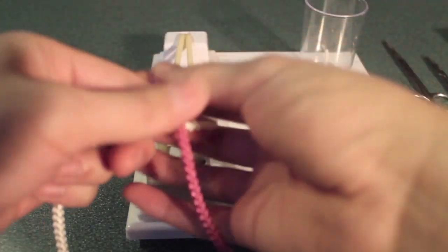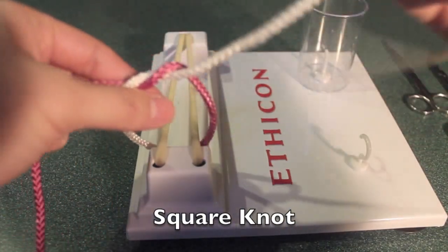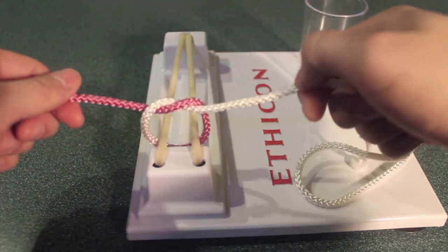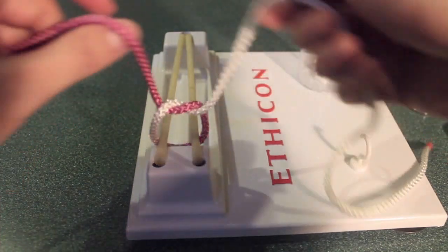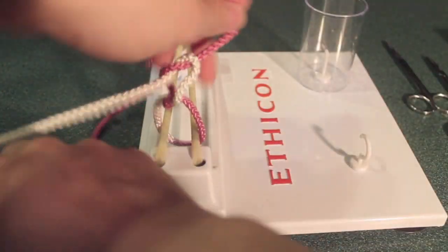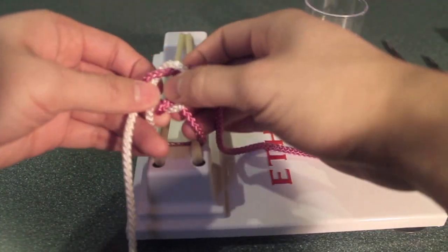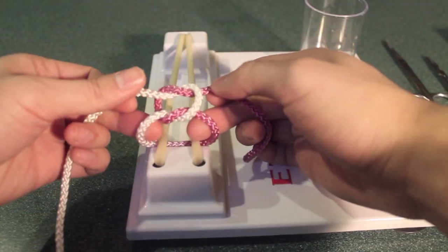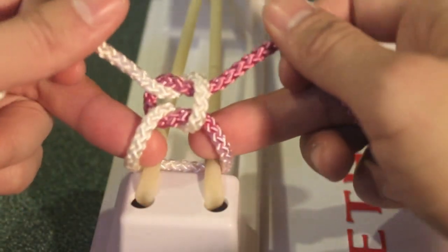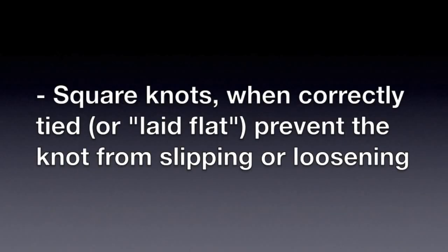Let's start with a square knot. This is the basic knot that you'll be tying most of the time. It's composed of one twist on the bottom and another twist on the top. You can see without tightening down, there's one twist on the bottom and one on the top. Square knots, when you're tying them correctly or laying them flat, prevent the knot from slipping.